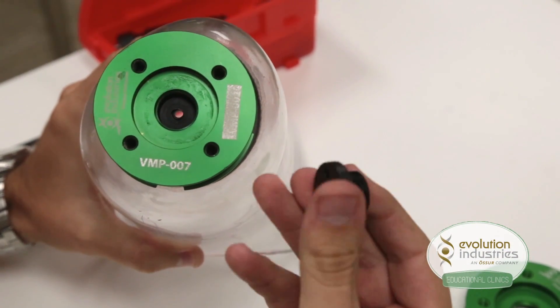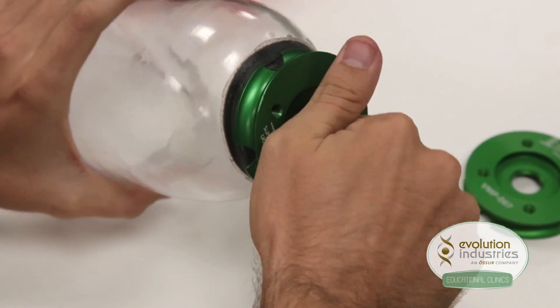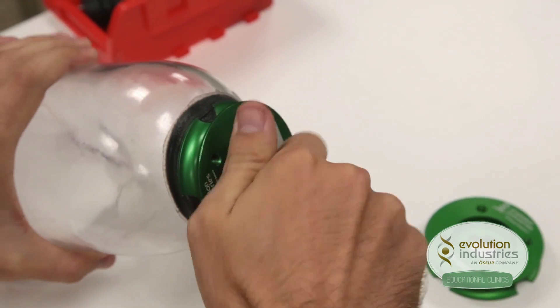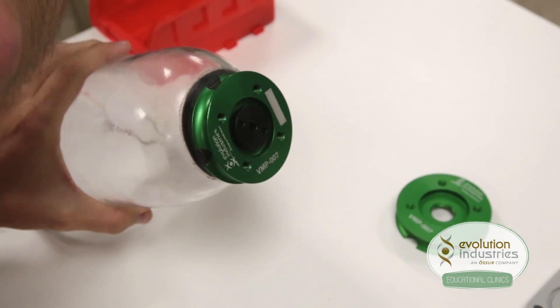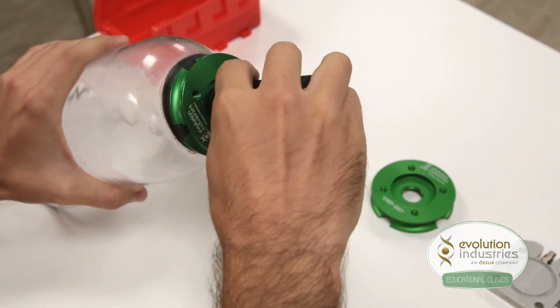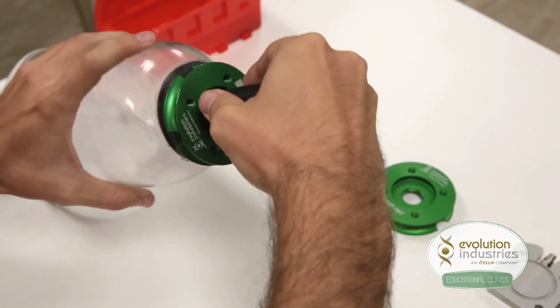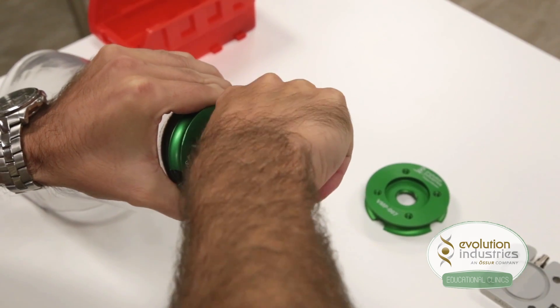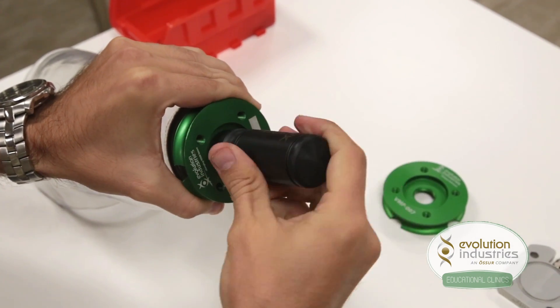Take your expulsion valve housing and screw it in clockwise to secure it to the mounting plate. Use your wrench tool, part number WT-001, to tighten the housing and ensure a good seal on the distal end of the socket. Be sure not to over-tighten.